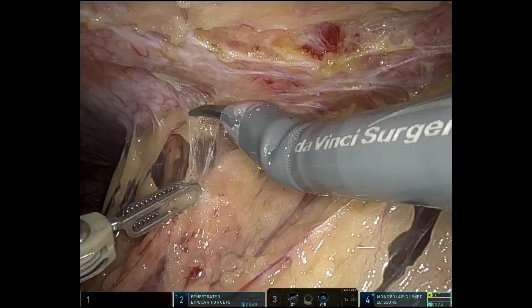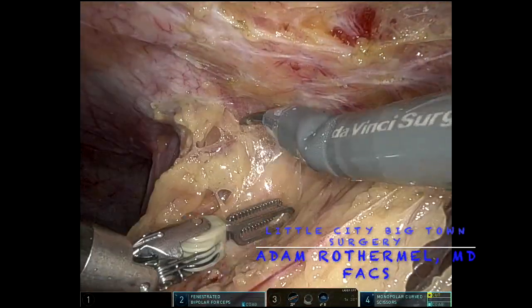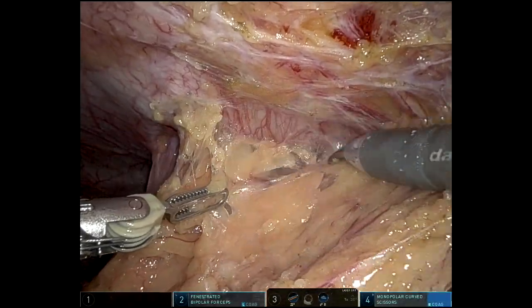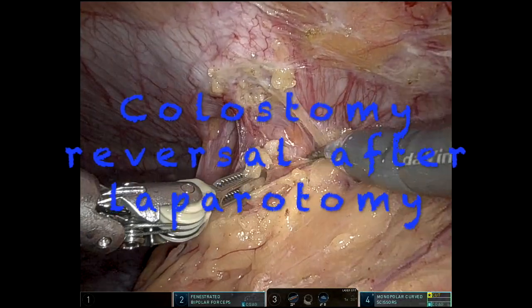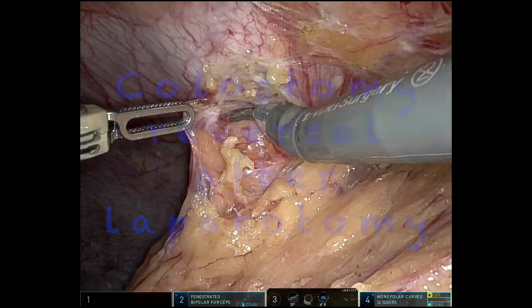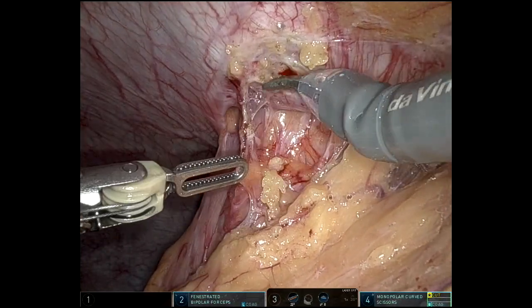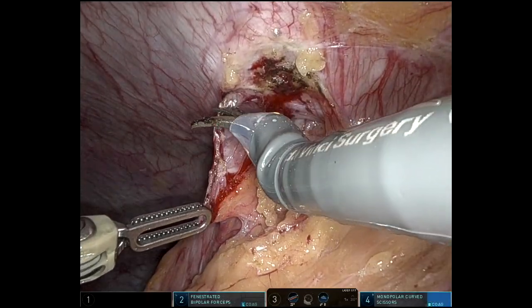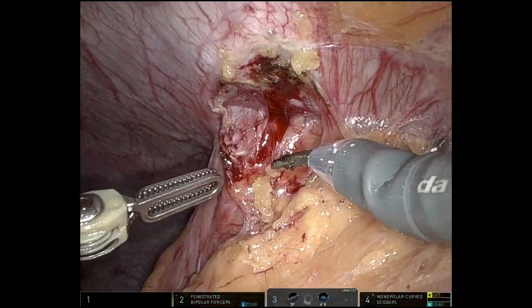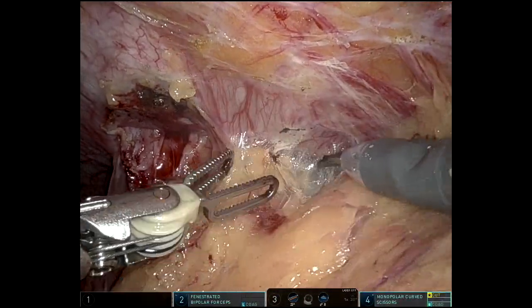Hello everybody. Presenting a robotic colostomy reversal after previous sigmoid colectomy via laparotomy. A 38-year-old woman who had an emergent exploratory laparotomy sigmoid colectomy for an obstructing sigmoid tumor. She's about six months out from that and presenting for colostomy reversal.